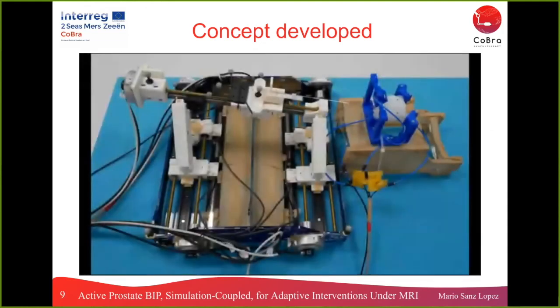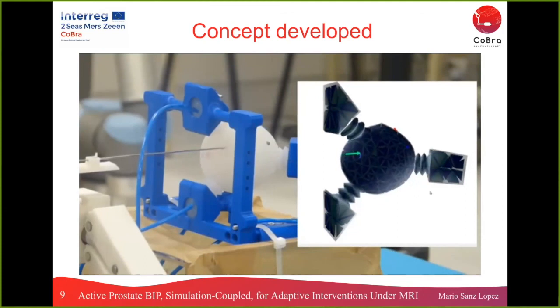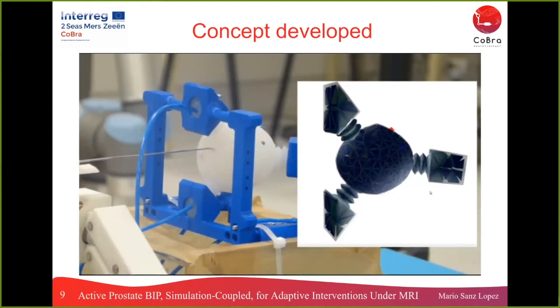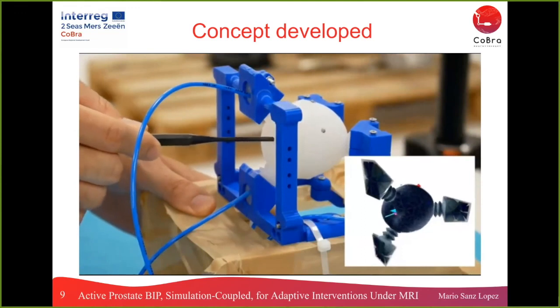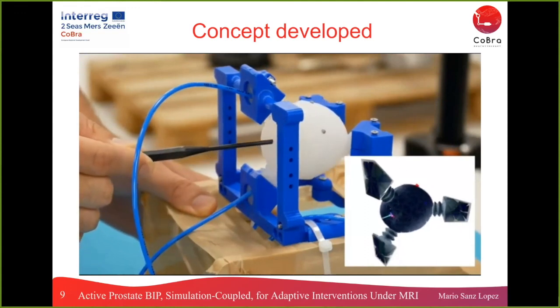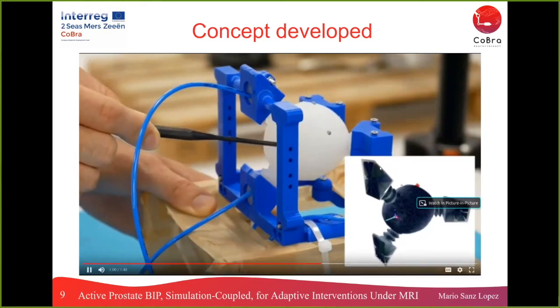So in our recent projects, obviously this all goes together with the CoBra Robot because it's a tool also to assess its accuracy. You can see a needle insertion. It's a little bit shifted just to provoke the organ motion, and this is being tracked in real time with those little gray markers that you have around here, so that we can assess the actual accuracy of the model. And it also can work more generally as an input device. This goes a little bit beyond the medical interest and the medical scope, but it means that it can be used for some other goals that are beyond the clinical ones.